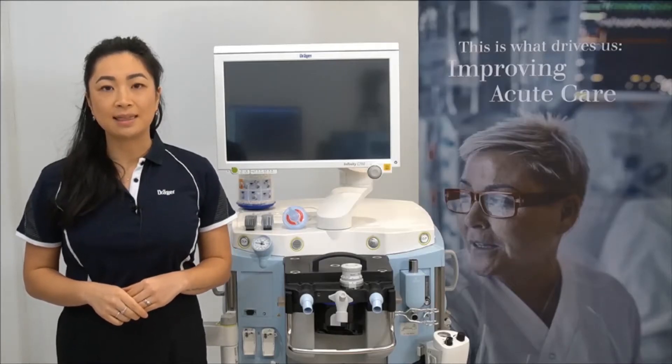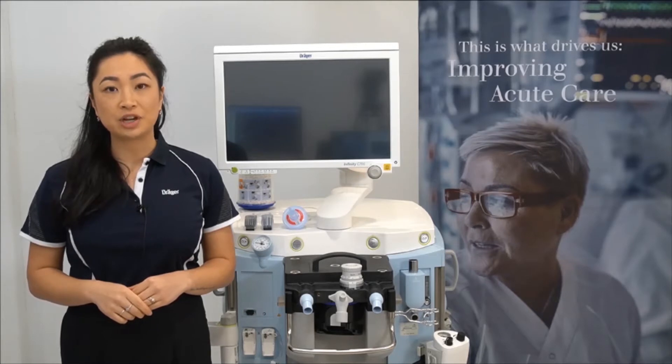Hello, my name is Samantha and in this video I'll be demonstrating how to prepare the Zeus IE for operation.